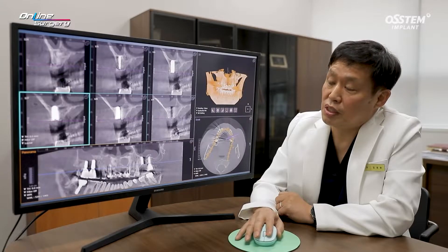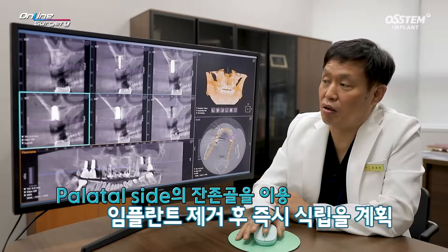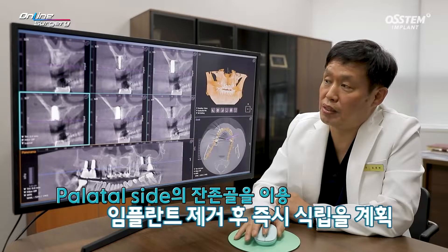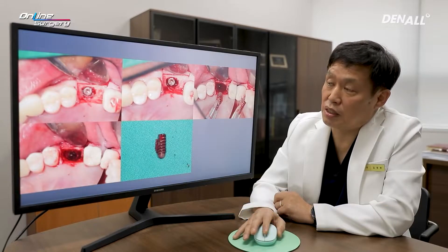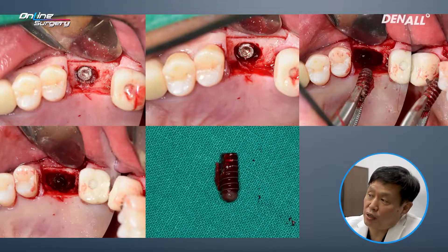In the case of this patient, the fractured implant was placed more buccally, so there is quite significant bone on the palatal side. Therefore, I thought I would be able to place the implant immediately after removal. This is an image taken during surgery. Fissure Burr was used, fulcrum was gained, and I used the elevator for implant removal — trying to minimize damage to the buccal plate as much as possible.